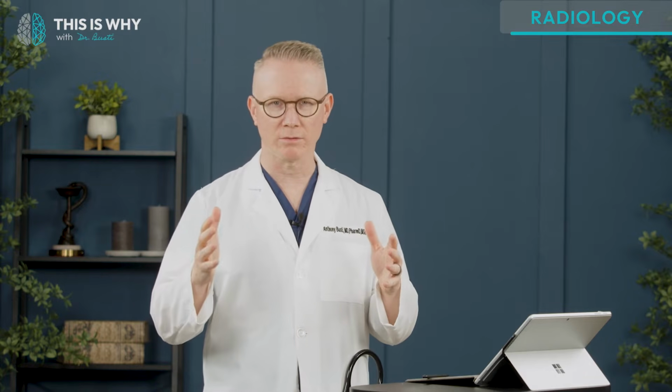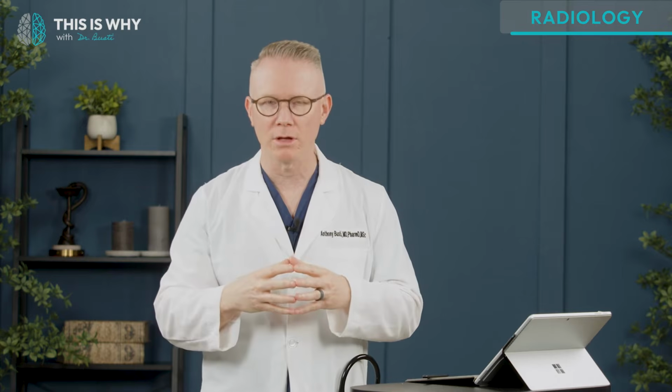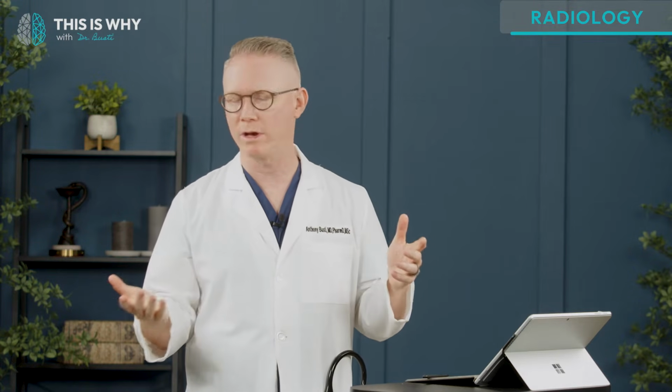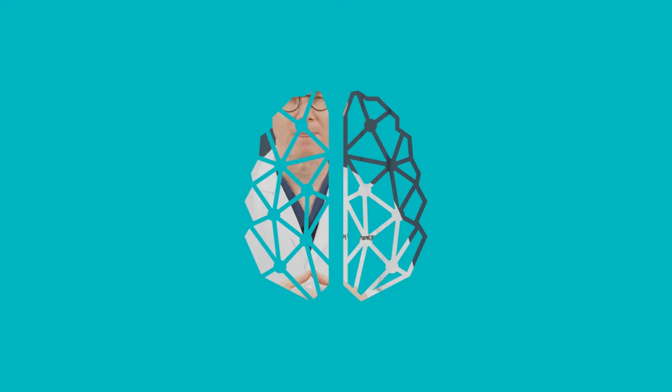Now, if you're looking at an AP chest x-ray, so anterior, posterior, where the x-ray beams are coming from the front and hitting the detector behind you, and the heart does look normal or not enlarged, then the PA, posterior anterior view, will not be larger than that. That means if the patient doesn't have cardiomegaly on an AP chest x-ray, they will not have cardiomegaly on a PA chest x-ray. I hope that made sense.